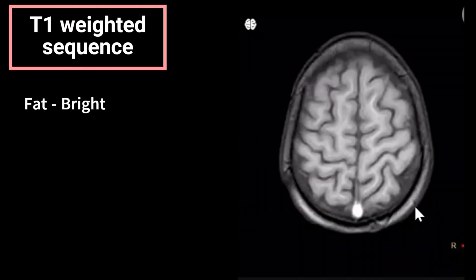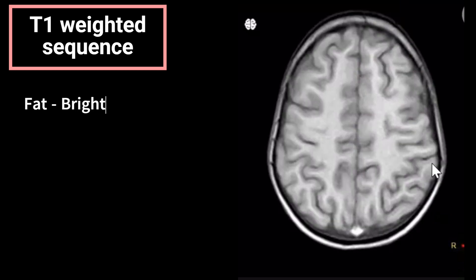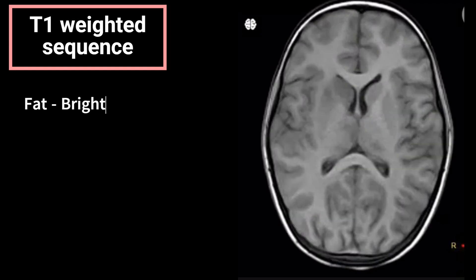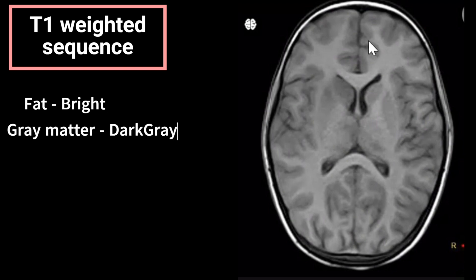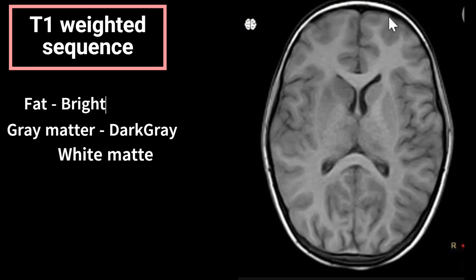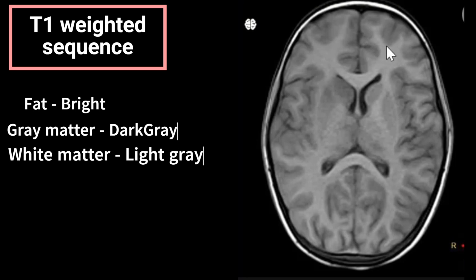To identify a T1 weighted sequence: fat appears bright on T1. Here you can see the subcutaneous fat in the scalp is bright or hyper-intense. Coming to lower sections, we can see gray matter and white matter. Gray matter here is the outer cortex appearing dark gray — we'll trace it along the cortex, which is very well defined on the T1 weighted sequence.